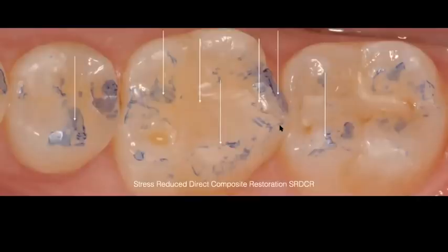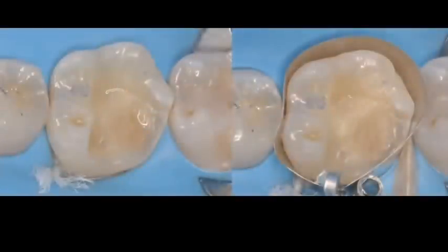Both of these concepts are going to help you reduce the amount of stress that is built up within your composite while you are polymerizing. But the other aspect that you want to keep in mind is that you will reduce the amount of stress built up on your composite occlusally. So if you have a good occlusal analysis and you end up with a stable occlusion, your restoration is going to suffer a lot less too.